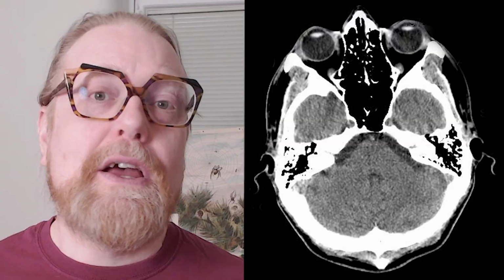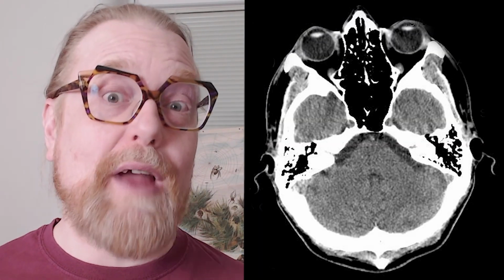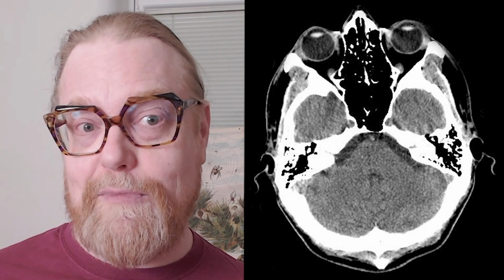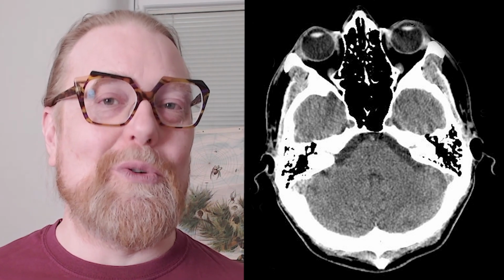Let's get to the main topic, X-ray tomography or slice imaging. Namely, you cannot take a picture like this by just putting the patient between the source and the camera. Tomography needs several measurements and some cool mathematics.